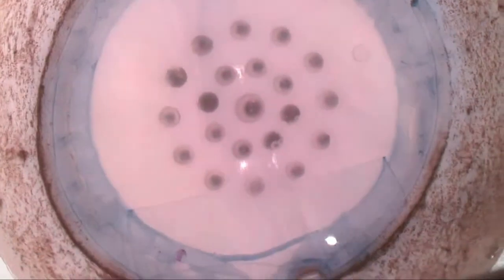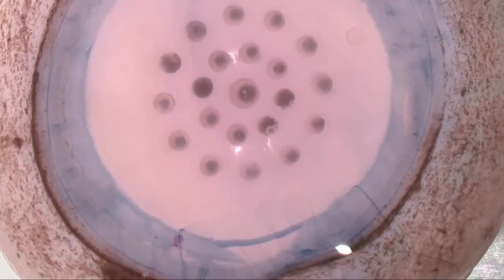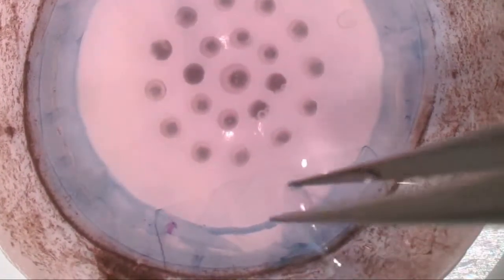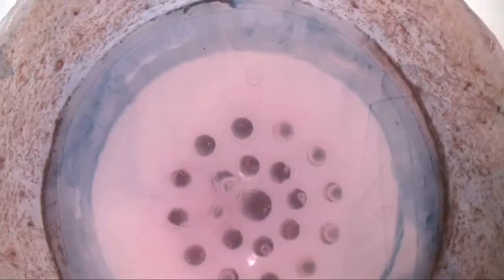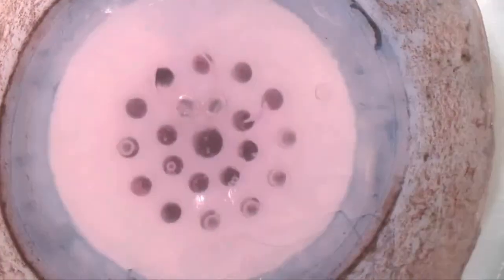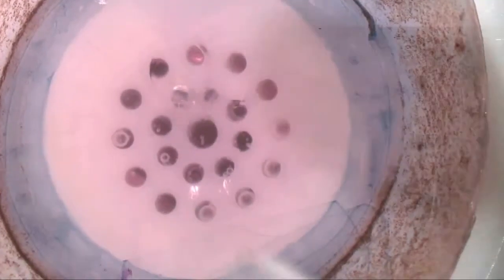First, the endothelium and Descemet complex is peeled off from the donor tissue and laid to the side. Then, a dermatologic 3mm trephine is used to punch the bare stroma full thickness and the endothelium is placed back into position.